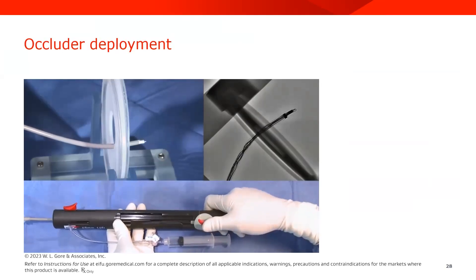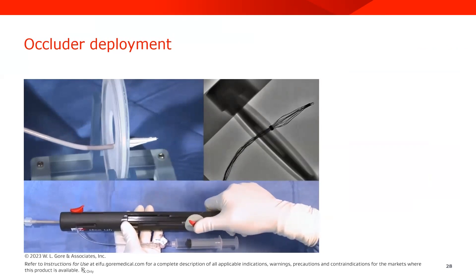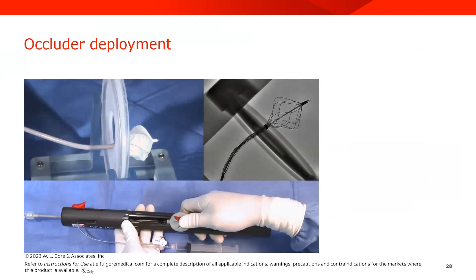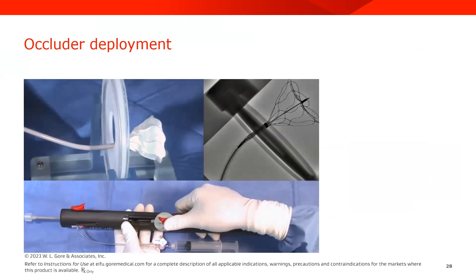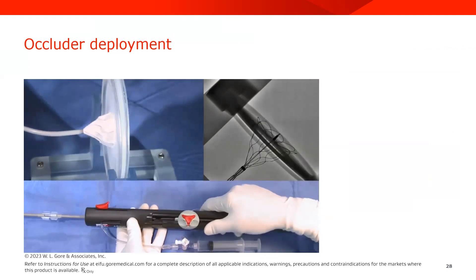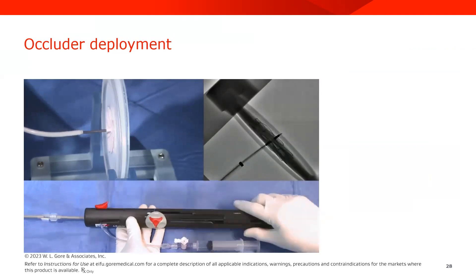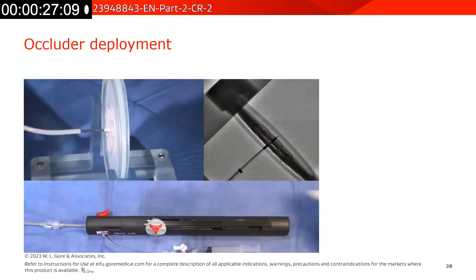We use this unsheathing technique to avoid interaction with the left atrial wall. When the left disc is fully formed, it will have a funnel shape, you can see here. We then pull it back towards the septum to pull back tension on that septum to continue to deploy the right disc. This ensures that the left disc is formed on the left atria and the right disc is formed in the right atria.